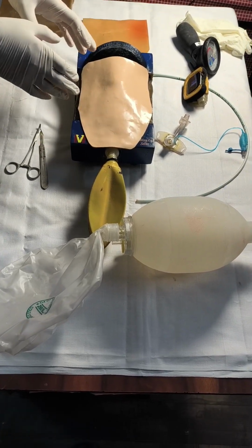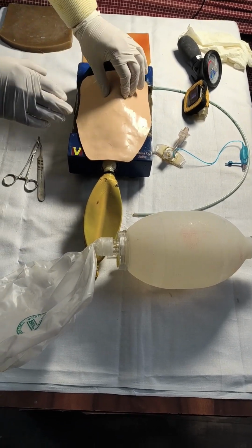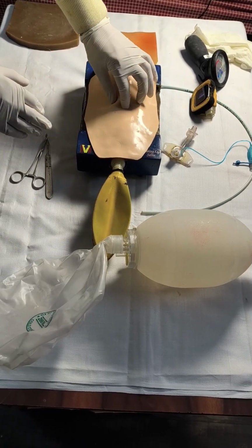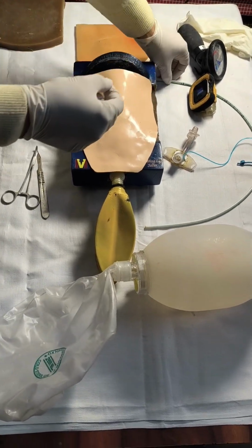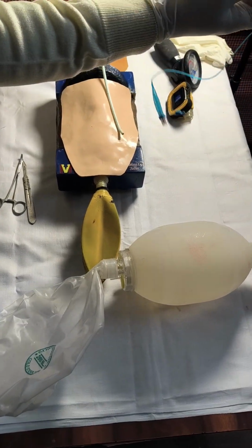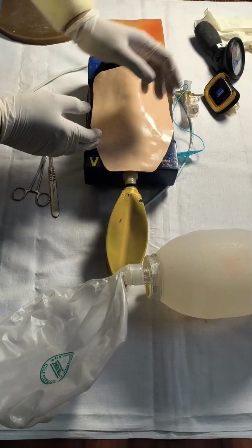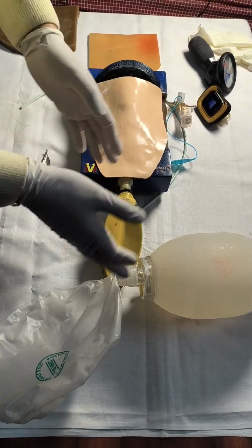One is mental visualization, which I'll be demonstrating. You have a model, you just visualize, not actually doing the procedure. You are feeling the cricothyroid space, and then you are doing the stab, and then you are imagining that you are passing the bougie, and over the bougie you are passing the tube, and then the tube is going into the cricothyroid space, the TT tube or the ET tube, and then you are inflating with the Ambu, you bag the patient, and there's a chest rise.